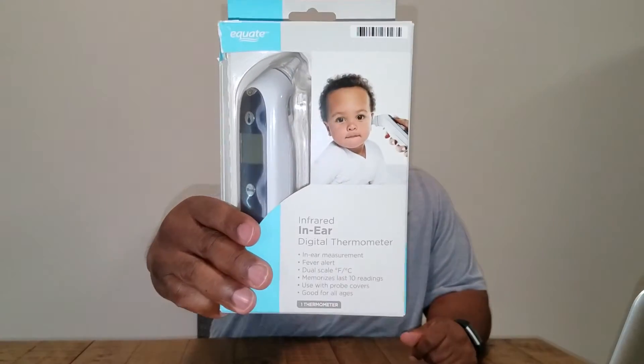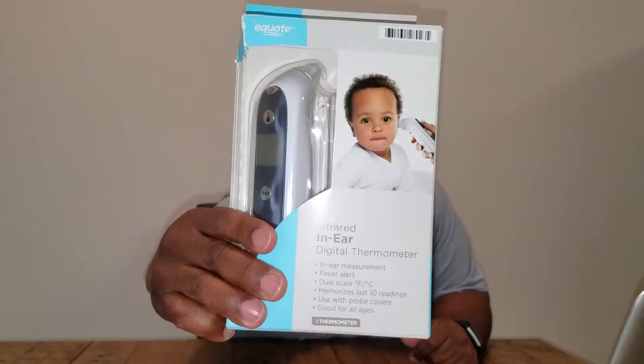Hey, what's going on guys? It's Jay Fry letting you know about this infrared in-ear digital thermometer. I'm going to talk about what I like about it, what I don't like about it, or if I even like it at all. I also let you know if it's worth it or not — something you need to have, or you can let it stay at the store. So I'm going to go ahead and take this thing out the box and check it out and see what it do.